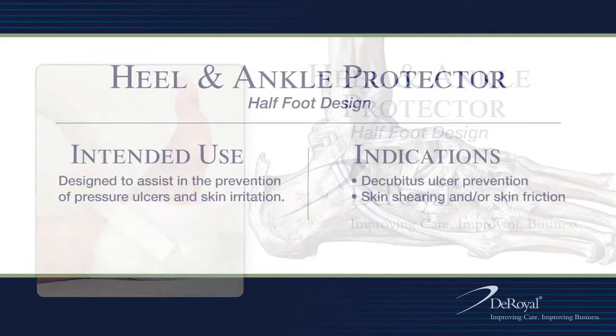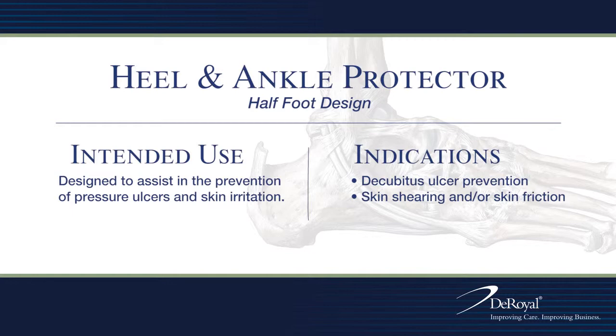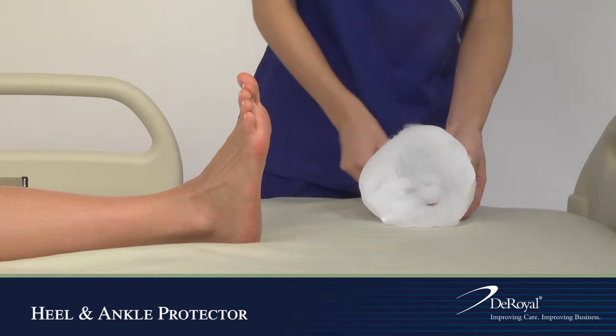DeRoyal Heel and Ankle Protector Half Foot Design. Place the patient's foot inside the heel protector and secure the strap with hook closure.